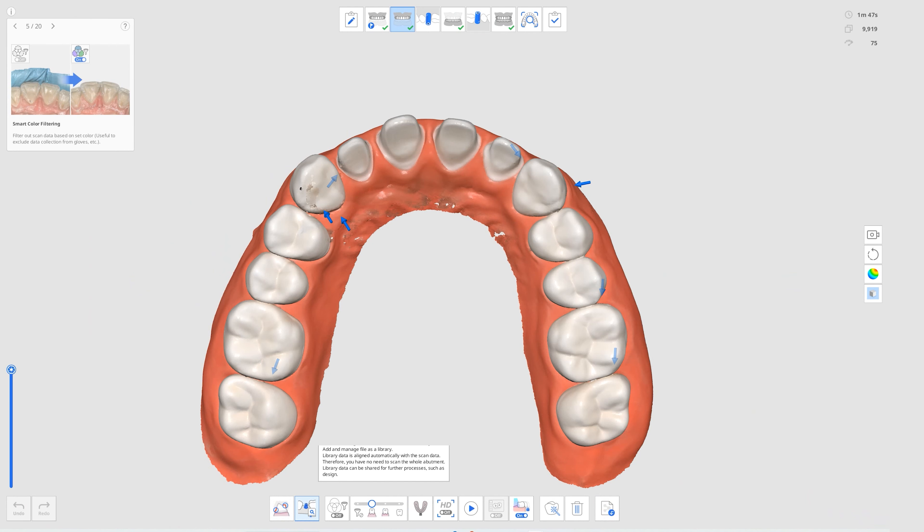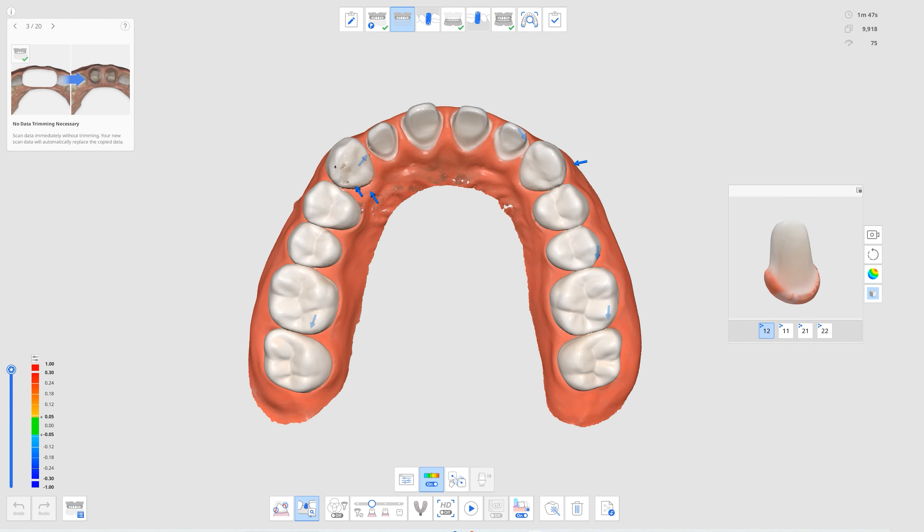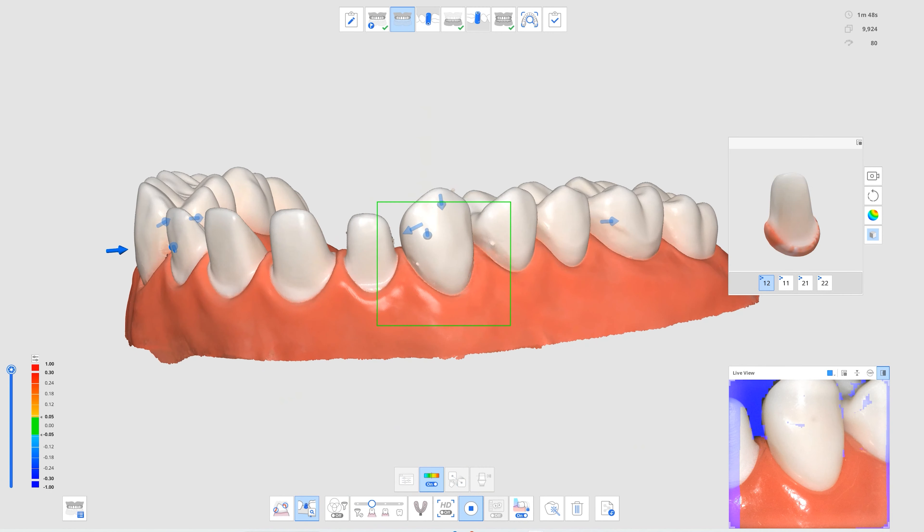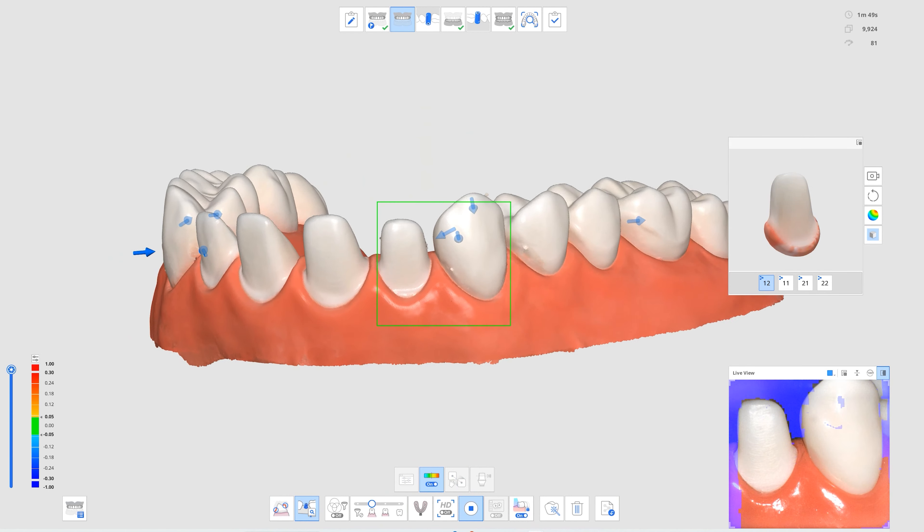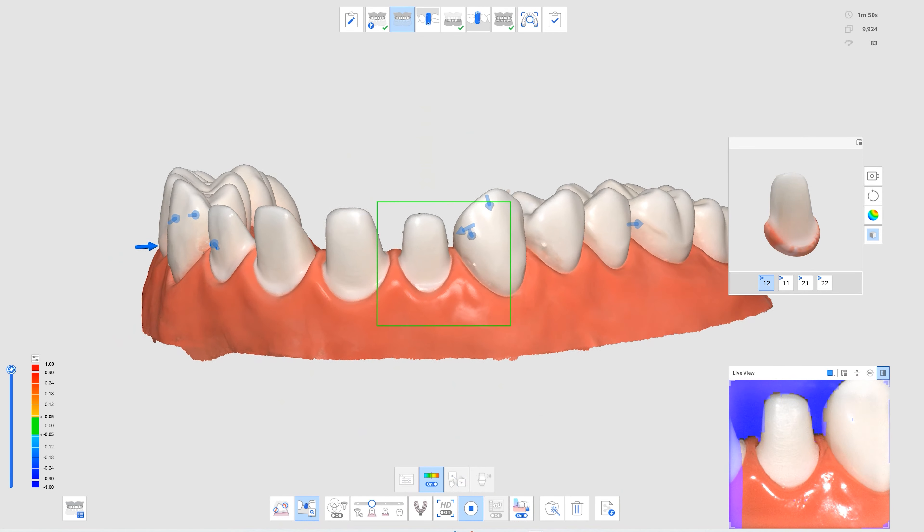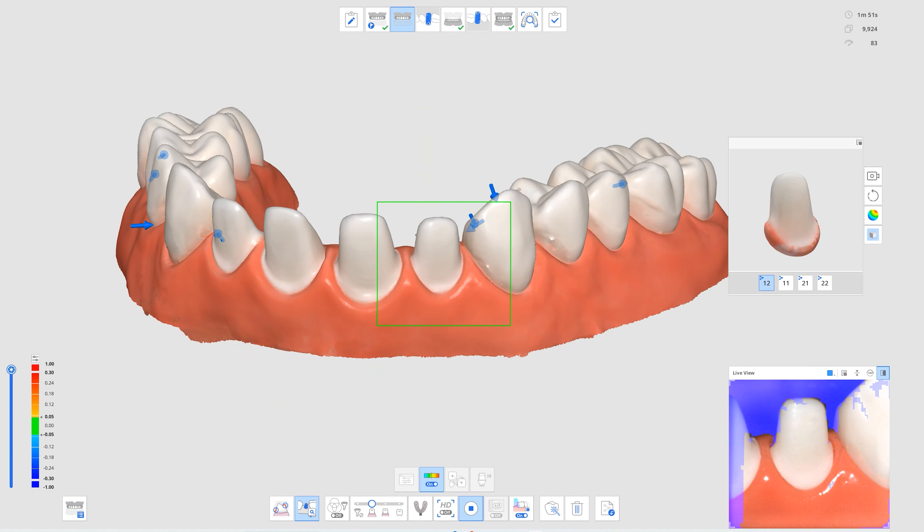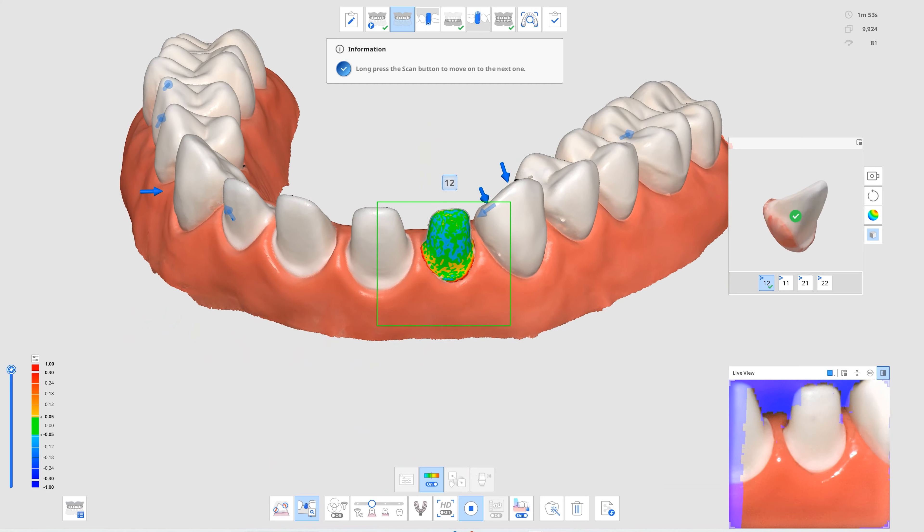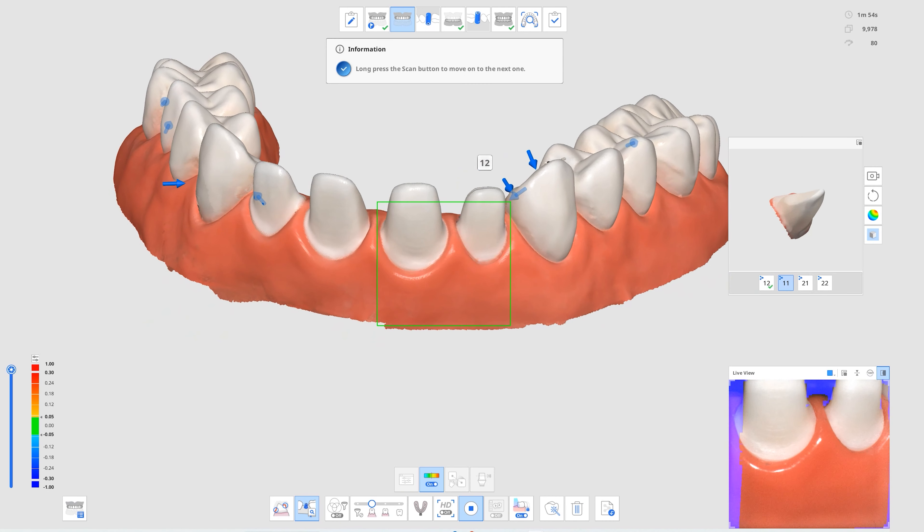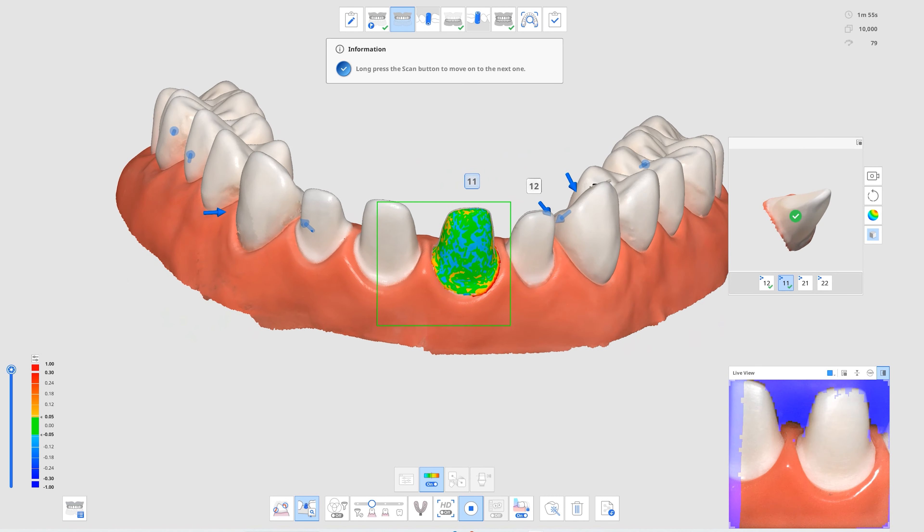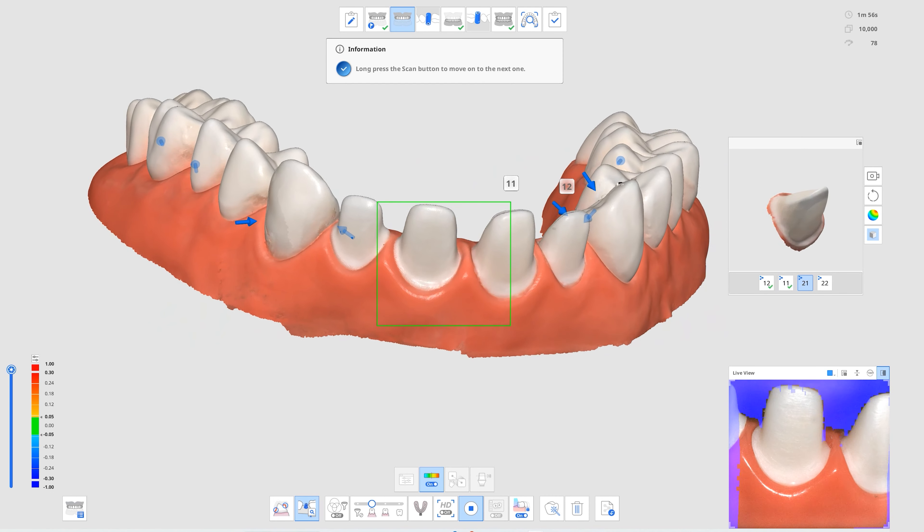Next, we improved library alignment. You can now acquire scan data regardless of tooth numbers and automatically align multiple abutments or scan body libraries during scanning or manually align them after the scan.